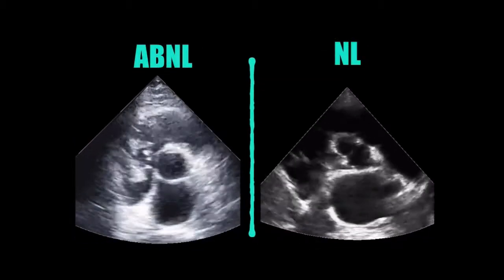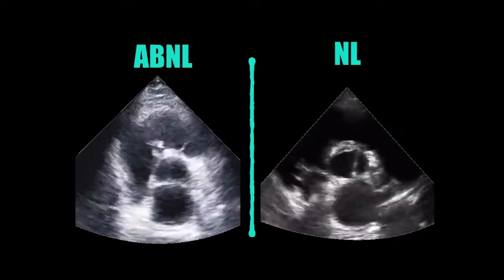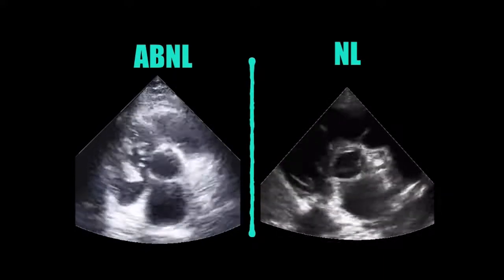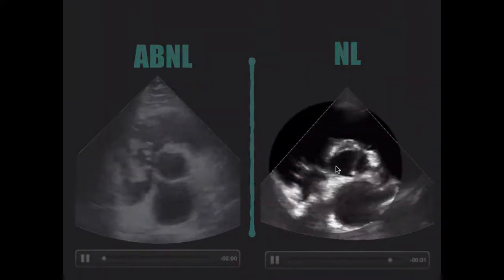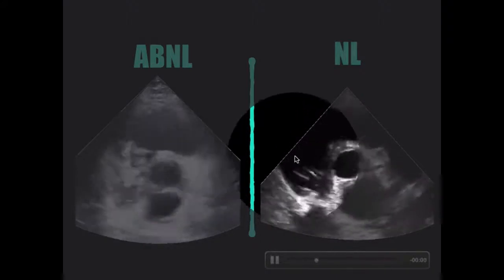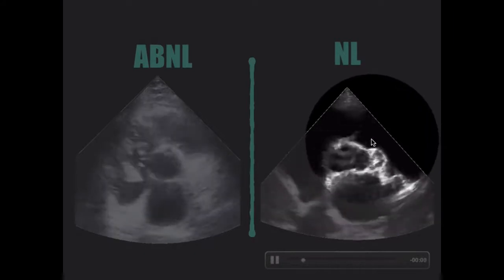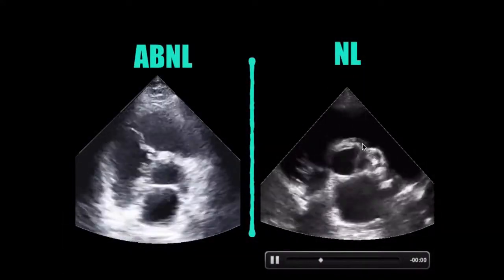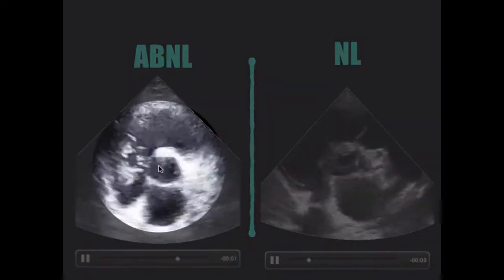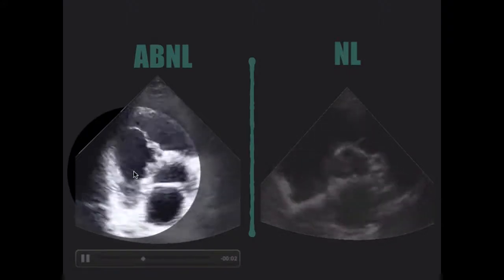Here's another one — a patient with right-side endocarditis. This is a parasternal short axis view, up a little bit towards the base, closer to the aorta. You can see the aortic valve here, the right atrium, the tricuspid valve, the right ventricle, and right here that little flappy thing is the pulmonic valve. Patients can definitely have pulmonic valve endocarditis as well. See that thing right there? Monstrous tricuspid valve vegetation.